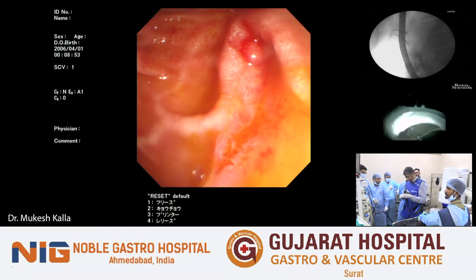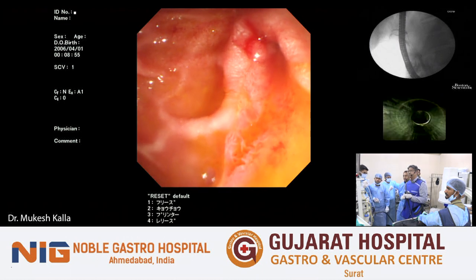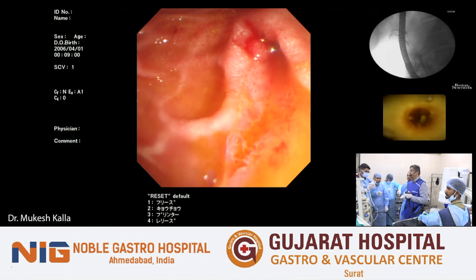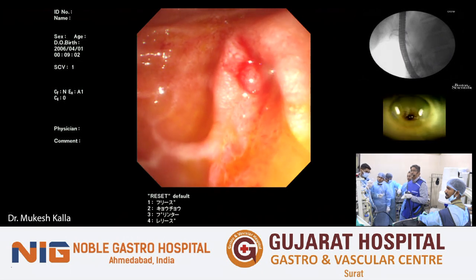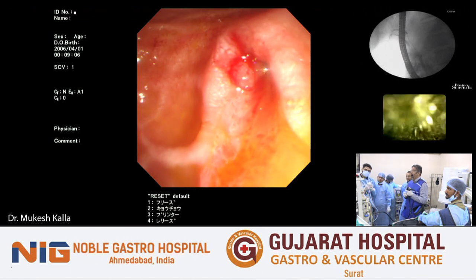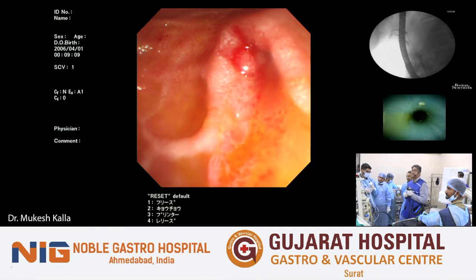But Nilay sir, when you are operating single-handedly, do you fix the right-left wheel of the cholangioscope once you achieve the center? Will this reduce the durability of the cholangioscope or not? No, I don't think so.